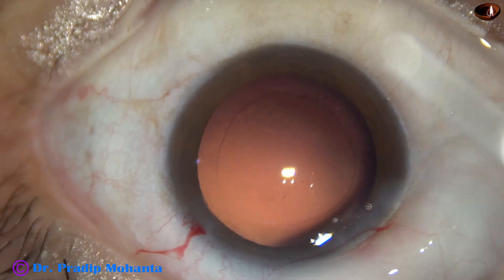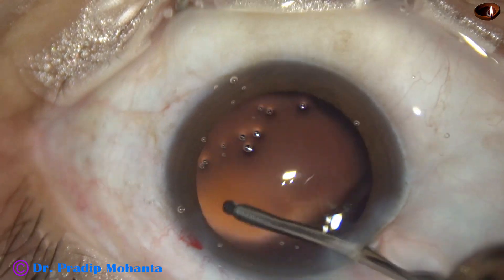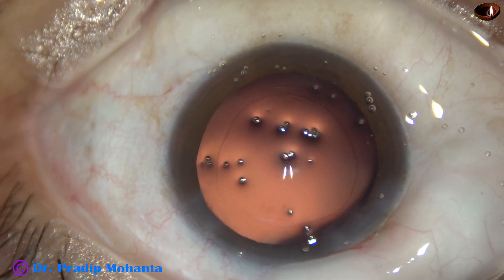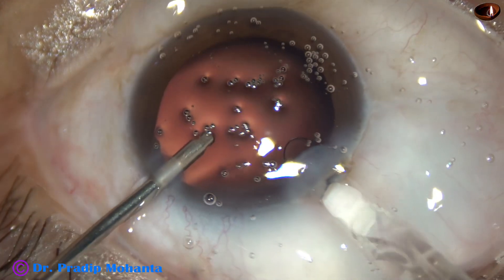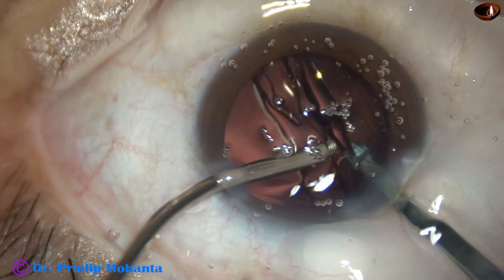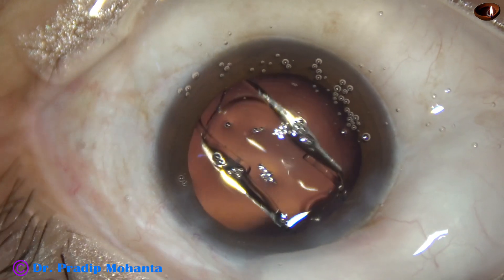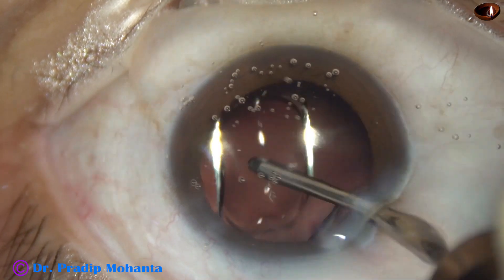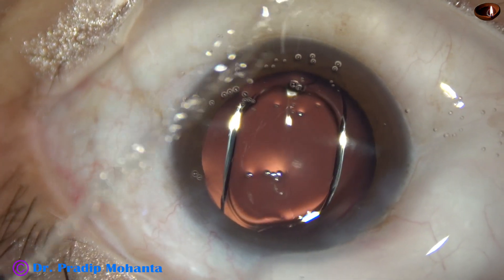And now an irrigation cannula is used to polish the posterior capsule. Then hydro-implantation of a single-piece monofocal intraocular lens is done. This is a hydrophobic acrylic single-piece aspheric monofocal intraocular lens. The lens has gone into the capsular bag.